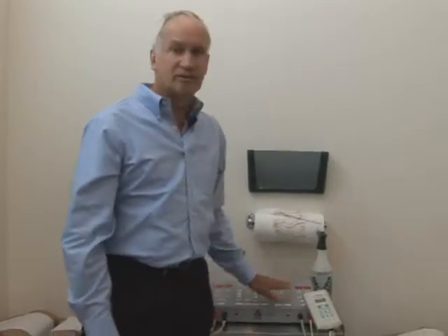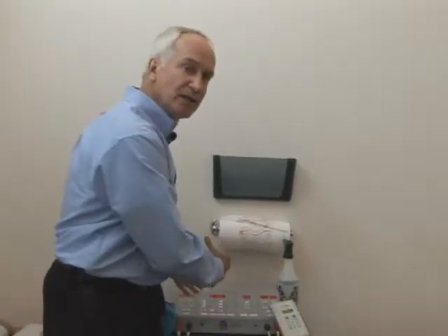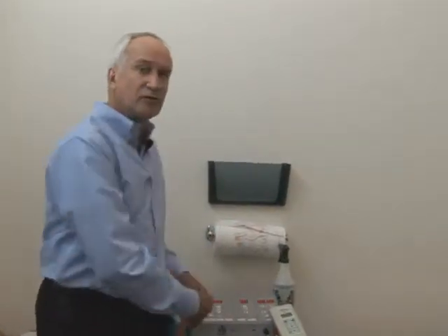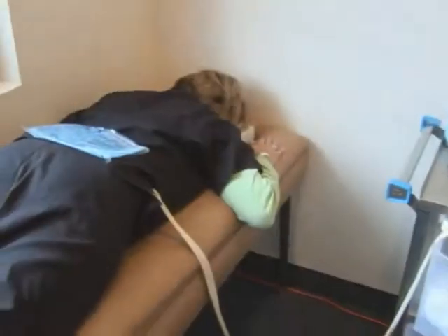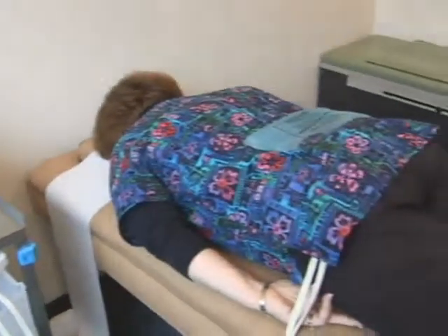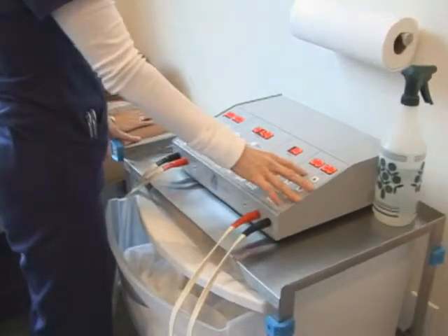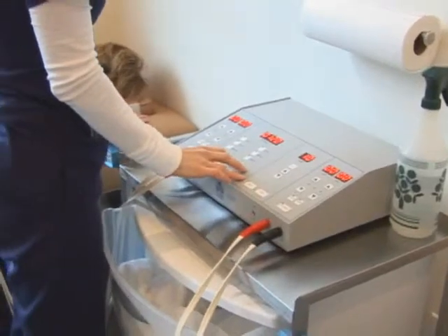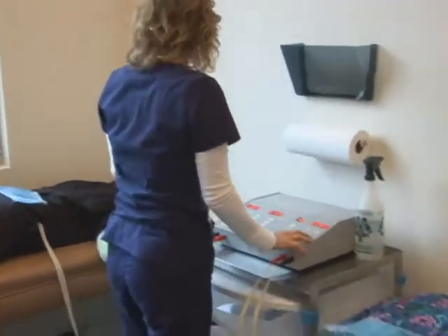And so that's one of the things when I talk with patients that I always tell them, have you ever been to a chiropractic office, physical therapy office, pain clinic? Have you ever laid down on the treatment table and had them put some electrodes on your back and turn a machine on and sort of walk away for 20 minutes and come back and say, how you feeling? If you've done that, chances are very likely it was interferential therapy.